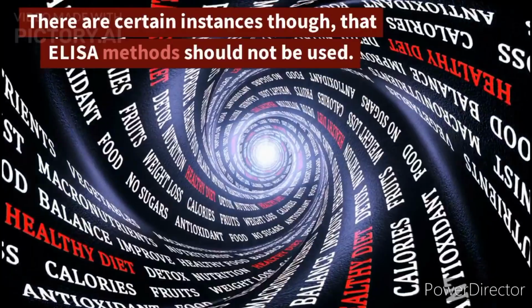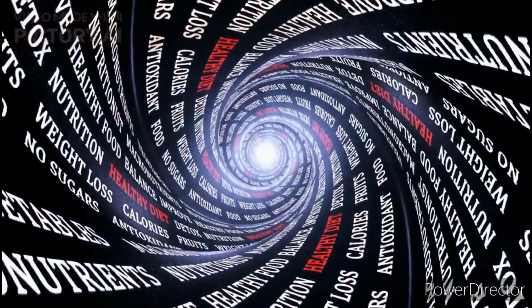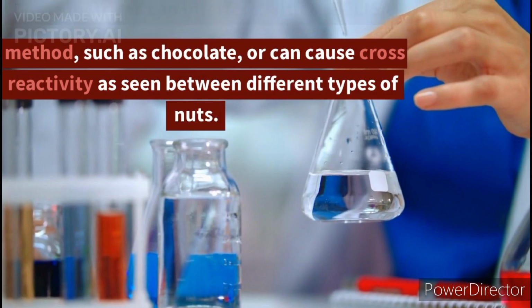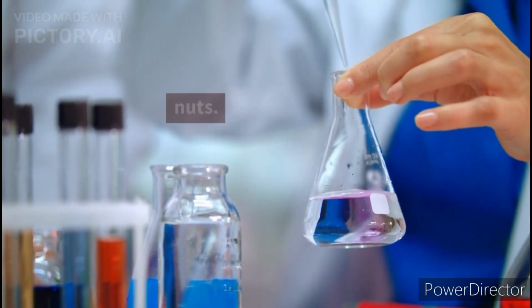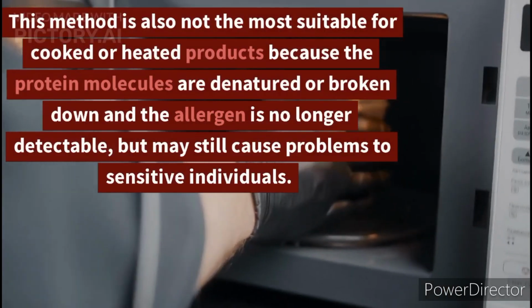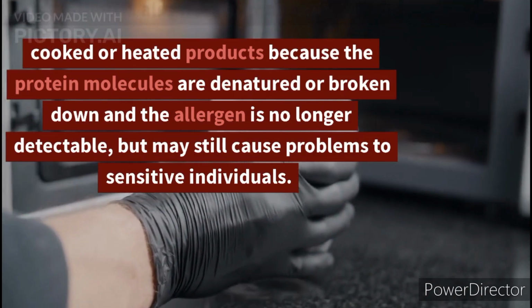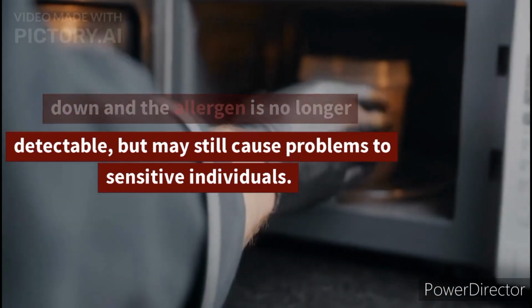There are certain instances, though, that ELISA methods should not be used. Some matrices can interfere with the ELISA method, such as chocolate, or can cause cross-reactivity as seen between different types of nuts. This method is also not the most suitable for cooked or heated products because the protein molecules are denatured or broken down and the allergen is no longer detectable, but may still cause problems to sensitive individuals.